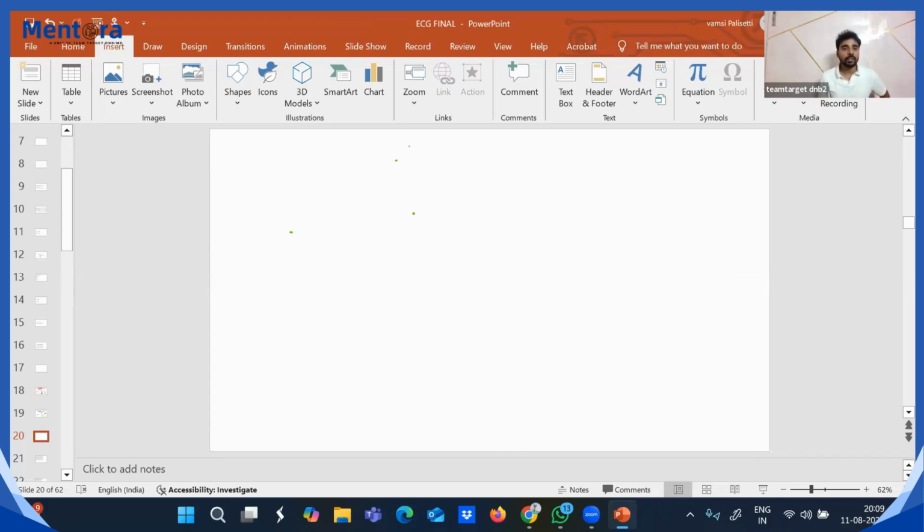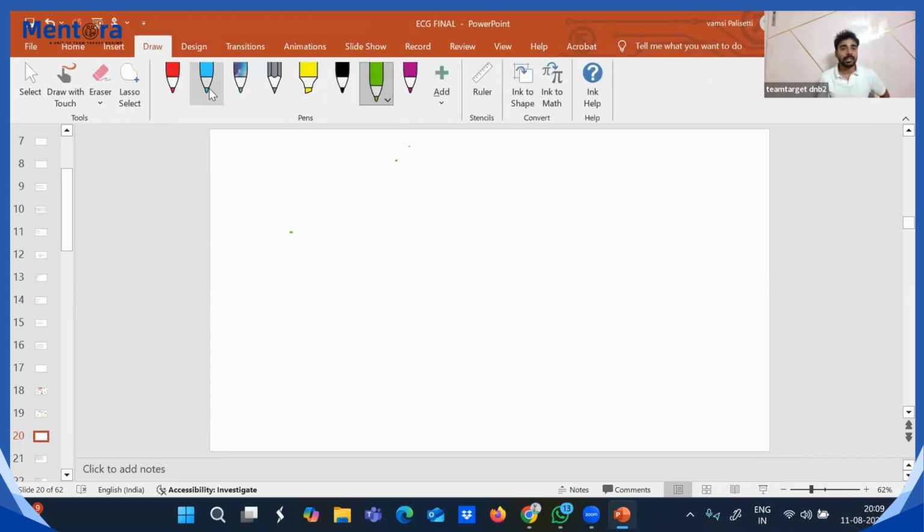Right. So simple, the basic common ECG is what you are saying. I'm just discussing that thing. Just a basic summary of this thing. Right. So I saw the ECG.